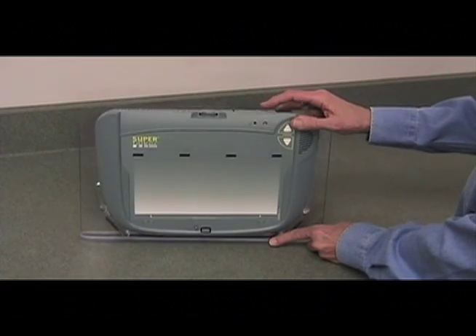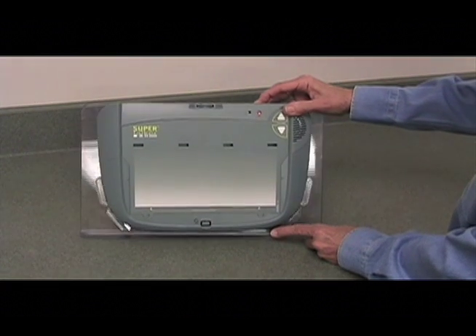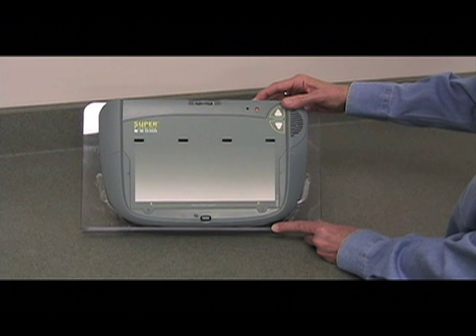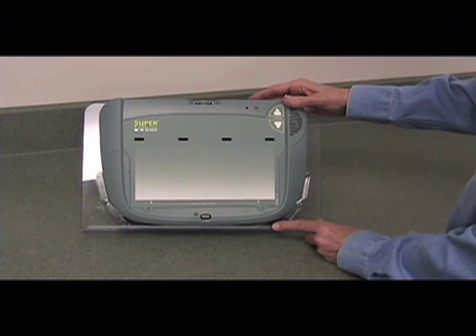To erase messages on the SuperTalker, very simple. You press the record button and hold it down until the red light disappears, at which point all your messages are erased.